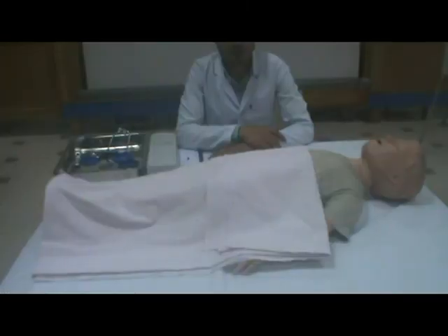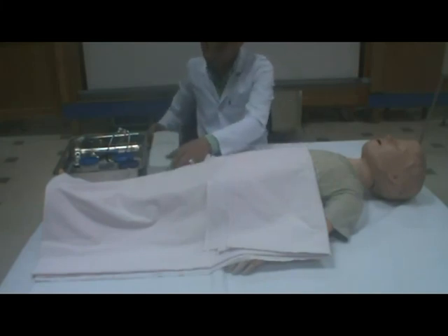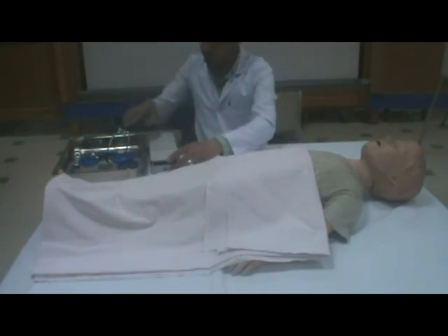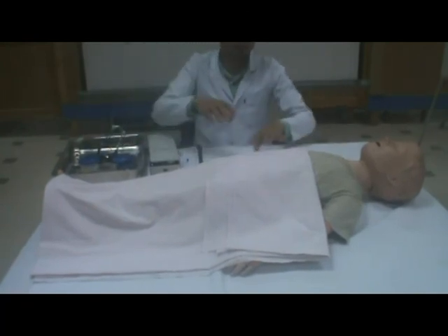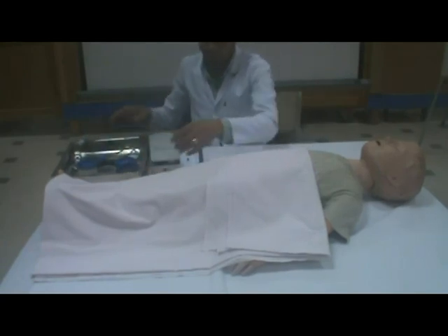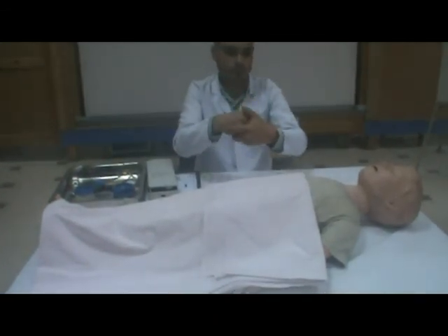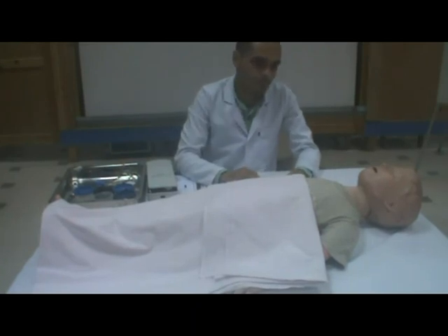Blood pressure equipment: various size blood pressure cuffs, sphygmomanometer and stethoscope, alcohol swab. Assemble the equipment to save time and effort. Wash hands to help remove microorganisms. Explain the procedure to the child or to his mother to gain their cooperation.